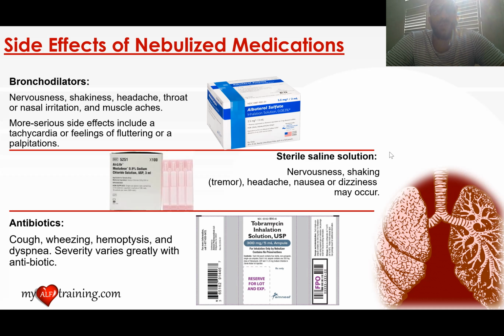But if it's someone who doesn't usually vomit but does complain of nausea, but we have a hard time getting them to eat, if it's a patient who doesn't like to finish their meals, then we don't want to make them nauseous before a meal, because they're not likely to finish that meal or even want to participate in the meal. So we want to assess our patient. You need to know your patient, what type of patient you have, as far as the nausea for a side effect, or maybe have a medication that will counteract that nausea beforehand.